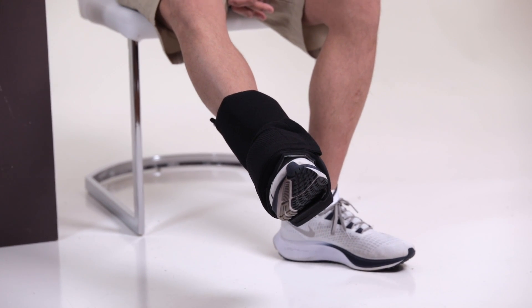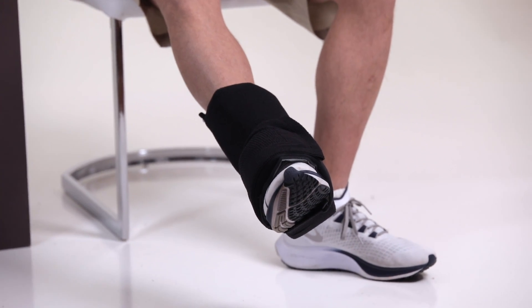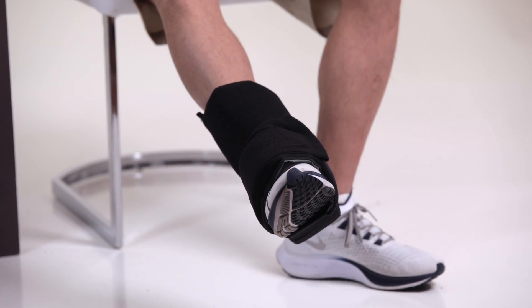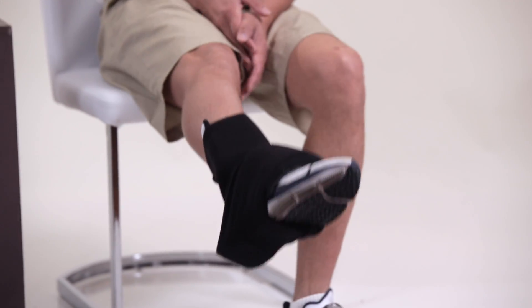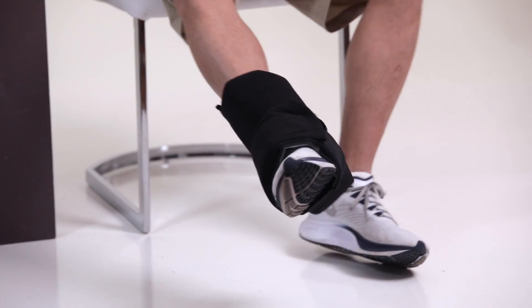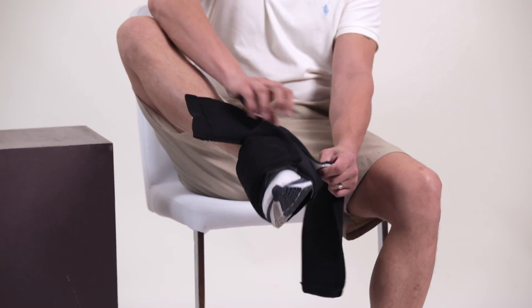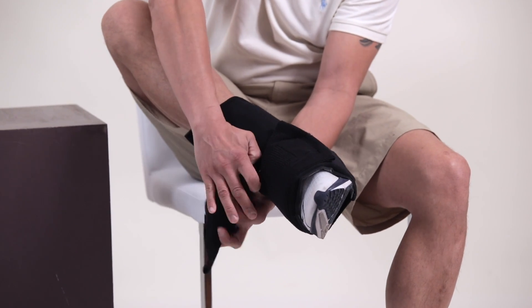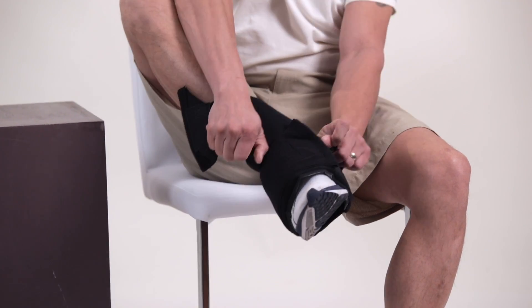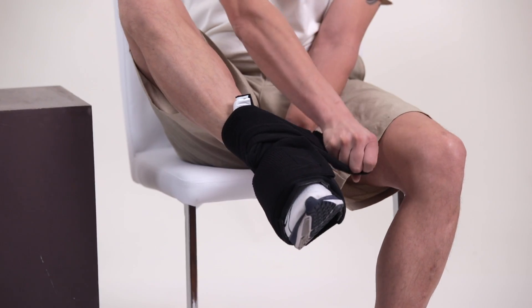Even if you have crutches and are getting around, in this case I'm still putting the compression straps on snug so that we can get that cold in place. I'm going to adjust this a little bit more to hit this part of the ankle — really it's just a matter of placement. So I'm going to do more of a diagonal approach here.